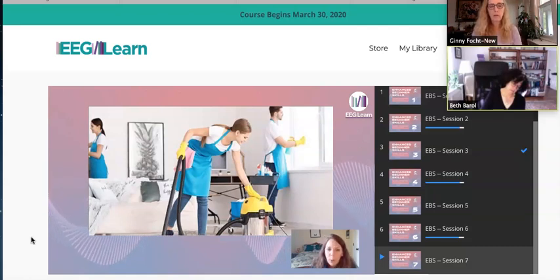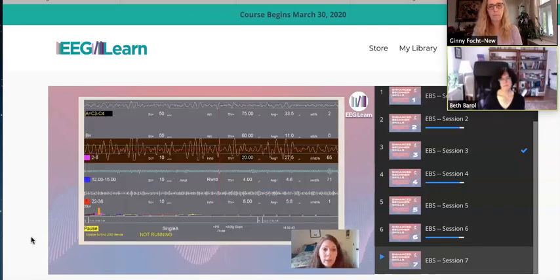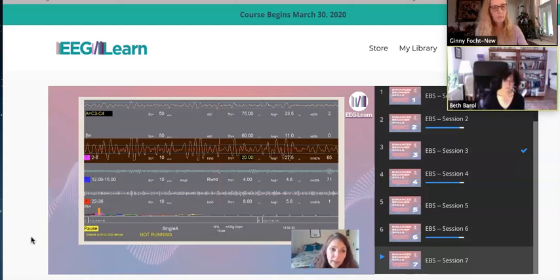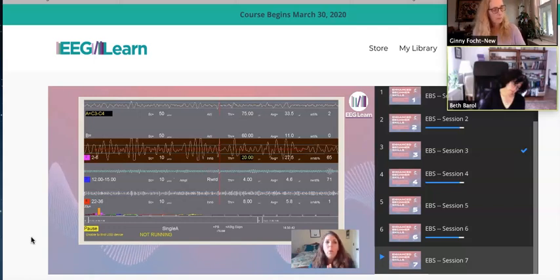You also do not want one of the 4 people in your house and the other 3 people in your neighbor's house. Not an efficient use of your manpower. So here, this is a C3 minus C4, and right now we're going to be talking about interhemispheric bipolar placements, where you have one sensor on the left side of the head and one sensor on the right side of the head.